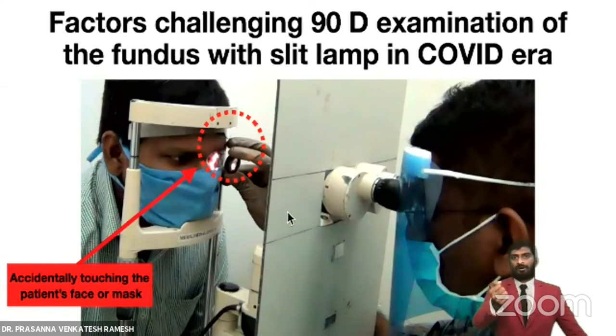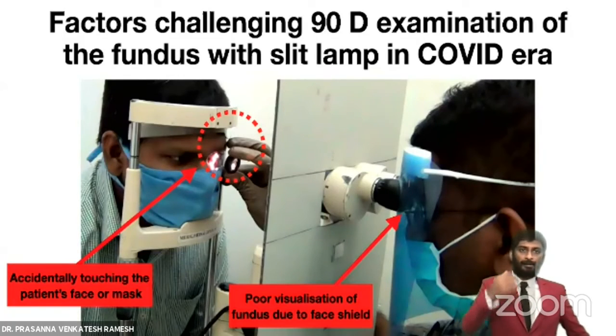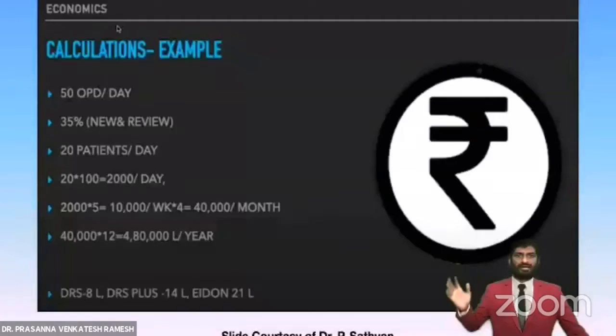And as Shweta pointed out, we are living in the COVID era where there are two main difficulties. One is accidentally touching the patient's face or mask. Second, if you are a shield guy, where you have a shield on your face or something, again, that is also going to cause a poor visualization of the fundus. So these are some challenges, and I'm just summing up. This is my last slide.